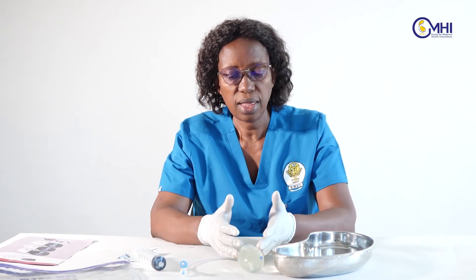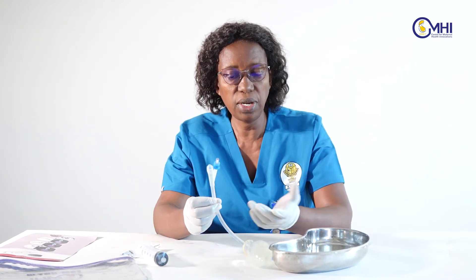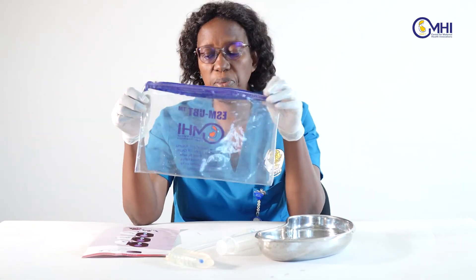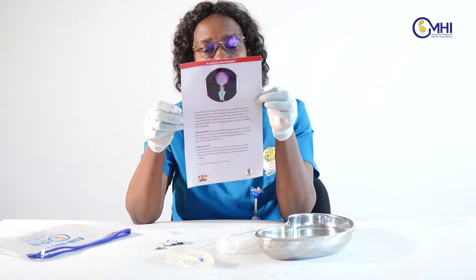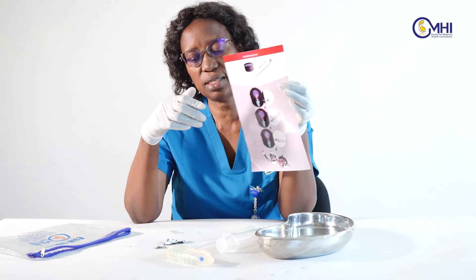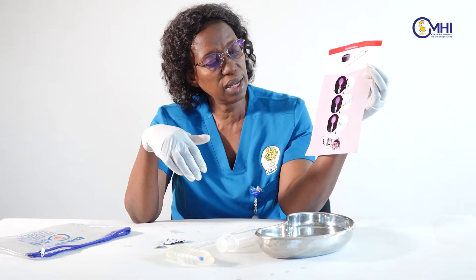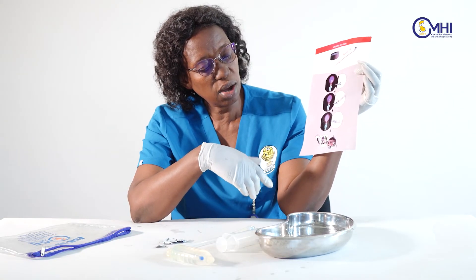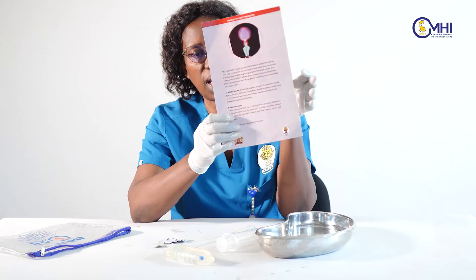After six hours, if you are convinced that the bleeding has completely stopped, you will start removing the balloon tamponade. For removal, we will do the reverse. In the ESM-UBT pack there is a small guide that can help you insert and remove the balloon tamponade, with clear instructions on how to insert, observe, and remove on both ends.